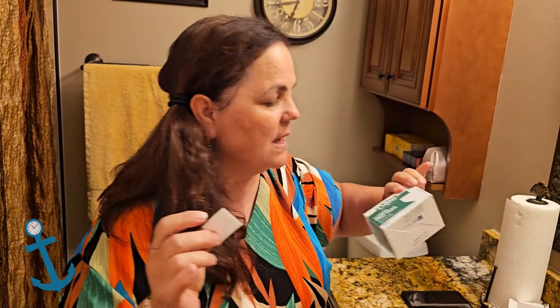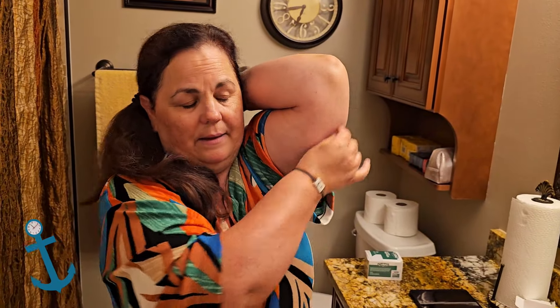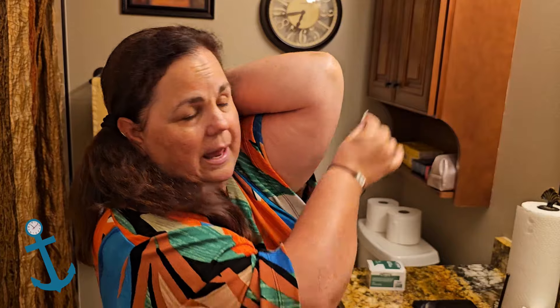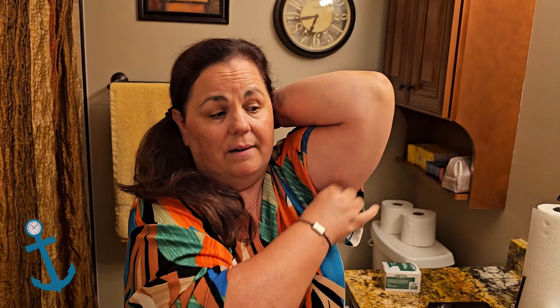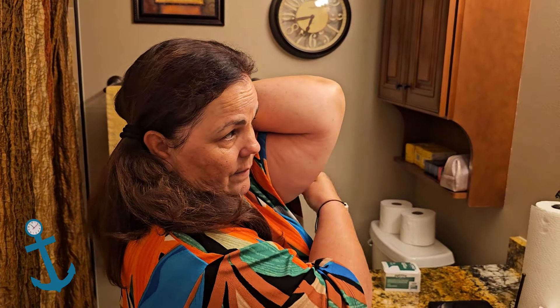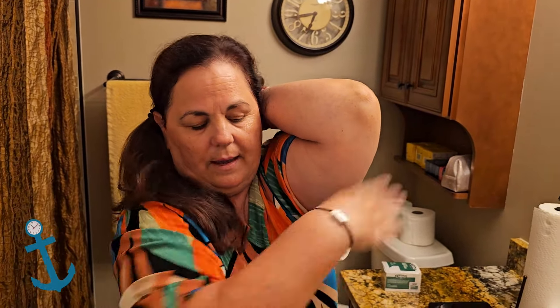First, wash your arm with soap and water — it's good to do this right after you've had a shower. Then you do an alcohol swab. Freestyle Libre used to come with alcohol swabs but they don't anymore, so you need to pick up a pack of alcohol swabs from the grocery store. You need to be really clean — you don't want any oils on your skin so that the sensor will stick and last the full two weeks.